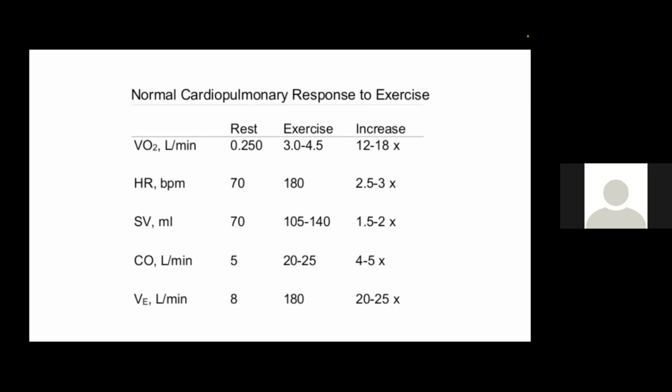So it's really important to know these parameters so we can identify the pattern of the patient based on this level. Is it abnormal or normal? So before interpreting the CPET, we need to know what is the normal and what is the abnormal level of these parameters.